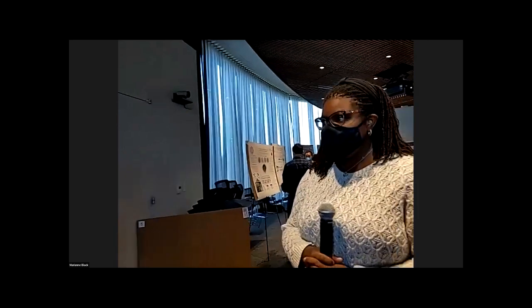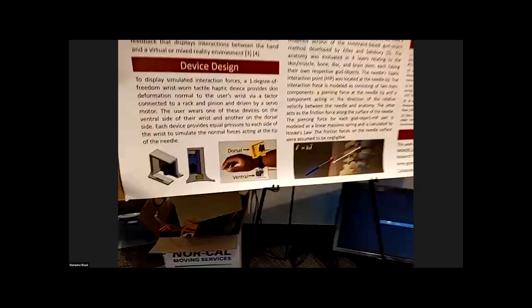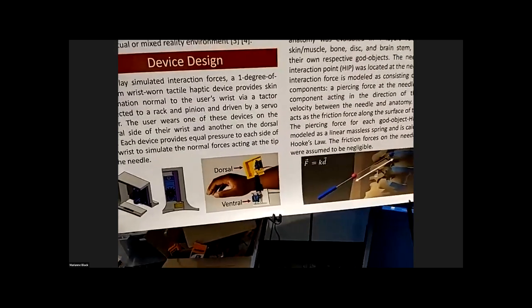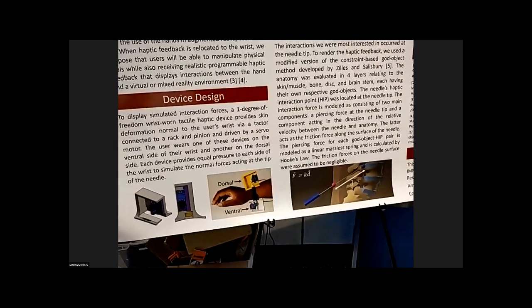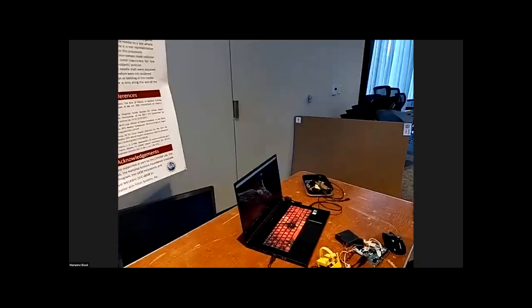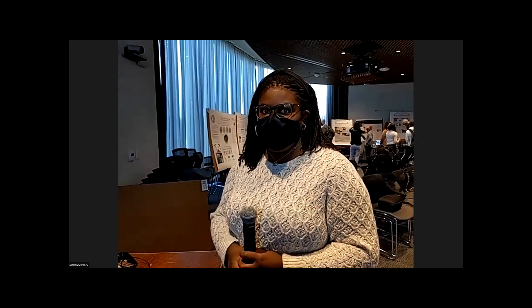Awesome. So is this part of your dissertation, or is this a past project? Yeah, so the devices are especially for my dissertation work. For the dissertation, I'm working on mapping the dorsal and ventral sides of the devices to specific forces acting on the index finger and the thumb. That is a bit more complex, and the modeling I do for the fingertips for that experiment is a lot more complex. But for the sake of this, I made the forces essentially equal on each of the servos so that you could just get an idea of if you've hit bone, if you've hit skin, if you've reached the spinal cord as well.